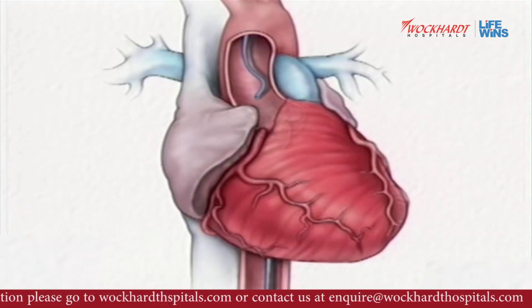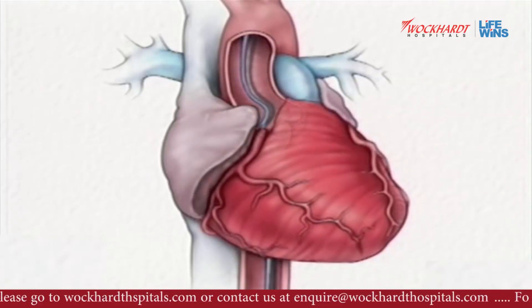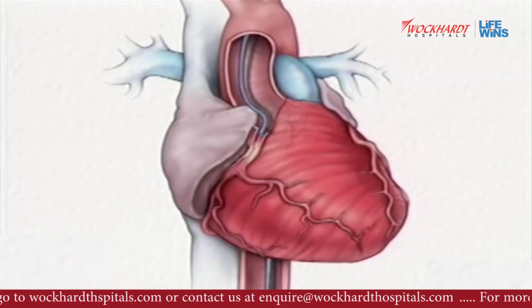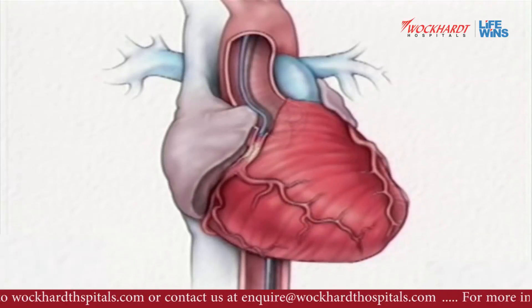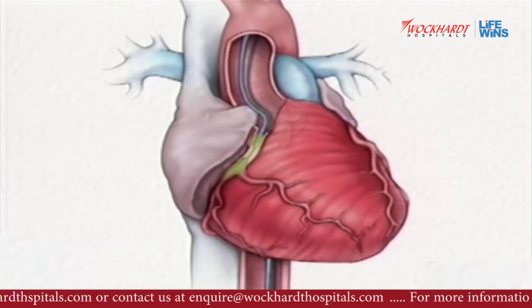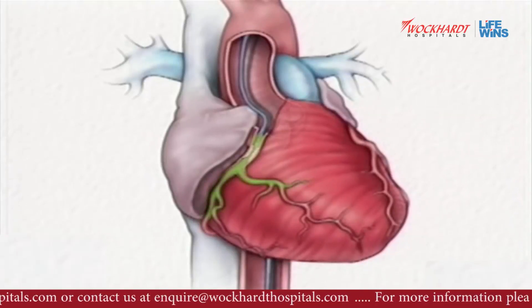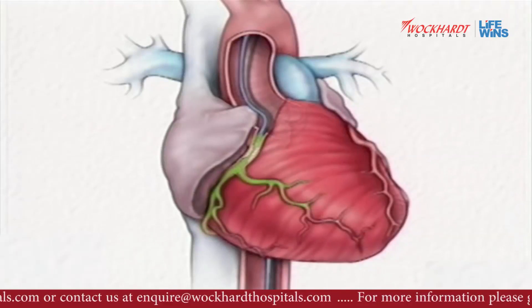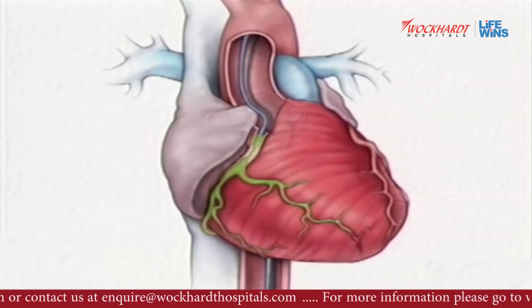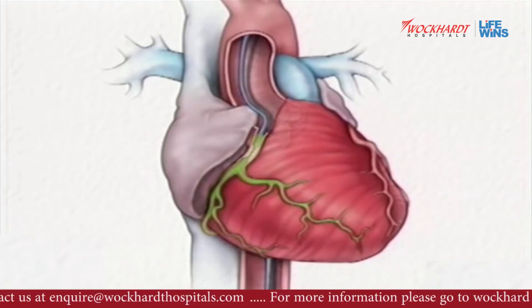There are three coronary arteries: two on the left, one on the right. After engaging the coronary artery, we inject a contrast — a dye — that shows us the anatomy of the arteries, whether they are normal or whether there is any blockage inside. Now I will show you one case.